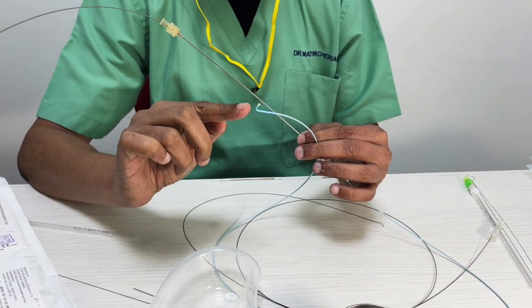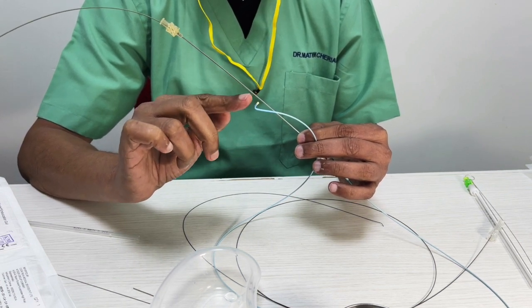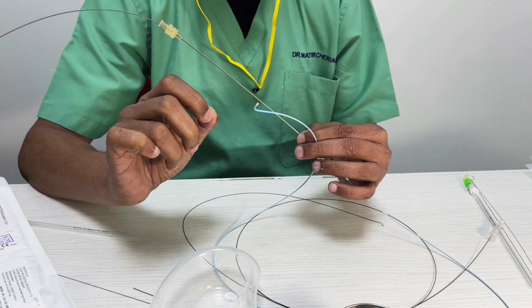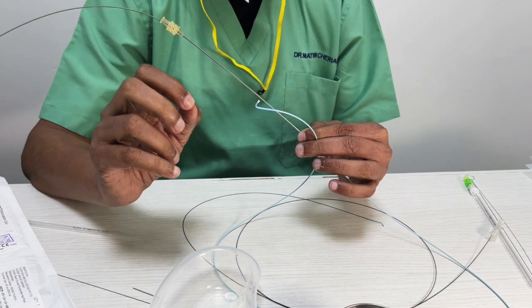Now the ideal position is to have this tip inside a small side branch, because what it does is it will take the coil, anchor it on the side branch, and then as you push, it will sort of weave and become a knot. But it's not always possible. So in that case, you can start pushing the coil.